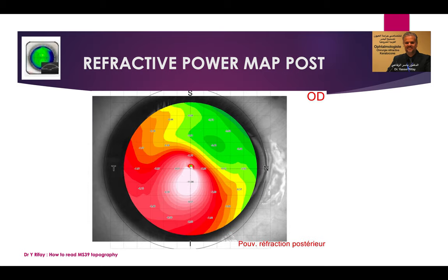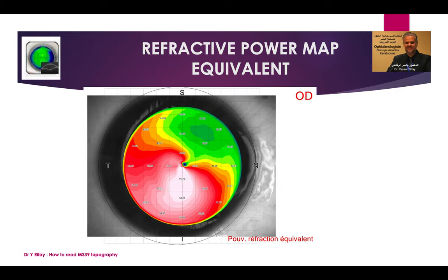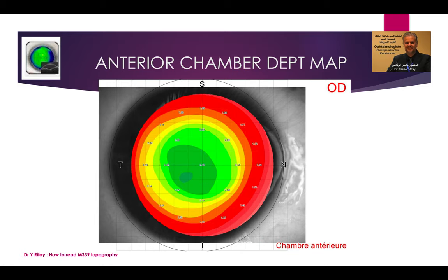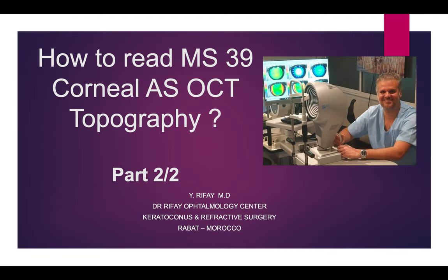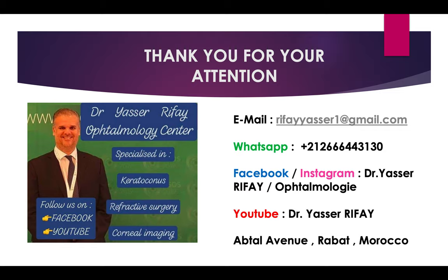There are other less commonly used maps: the refractive power map of the anterior surface, the refractive power map of the posterior surface, the equivalent refractive power map, and the anterior chamber depth map — which gives the depth of the anterior chamber at every point, measured from the lens or from the iris. Thank you very much. You will follow the second part of this presentation in another link, which will cover the other options of the MS-39.